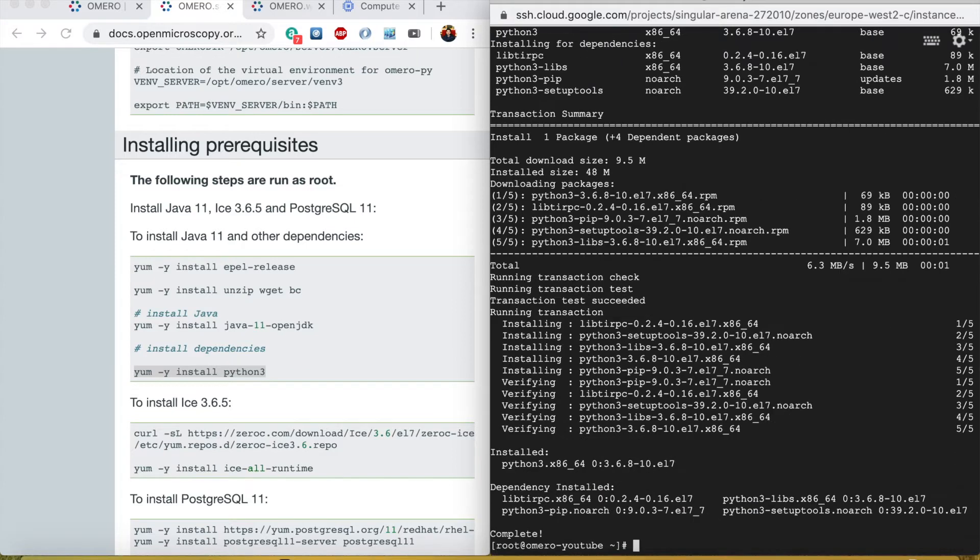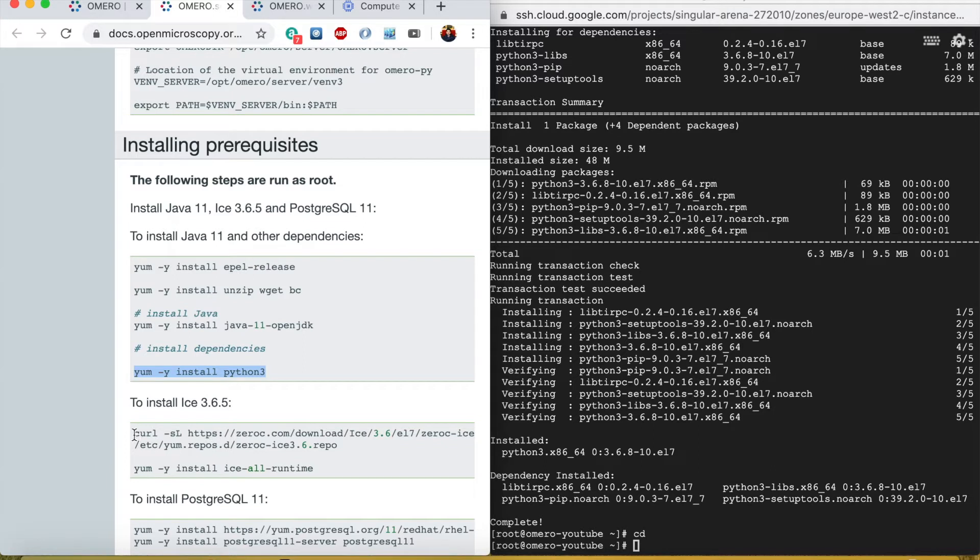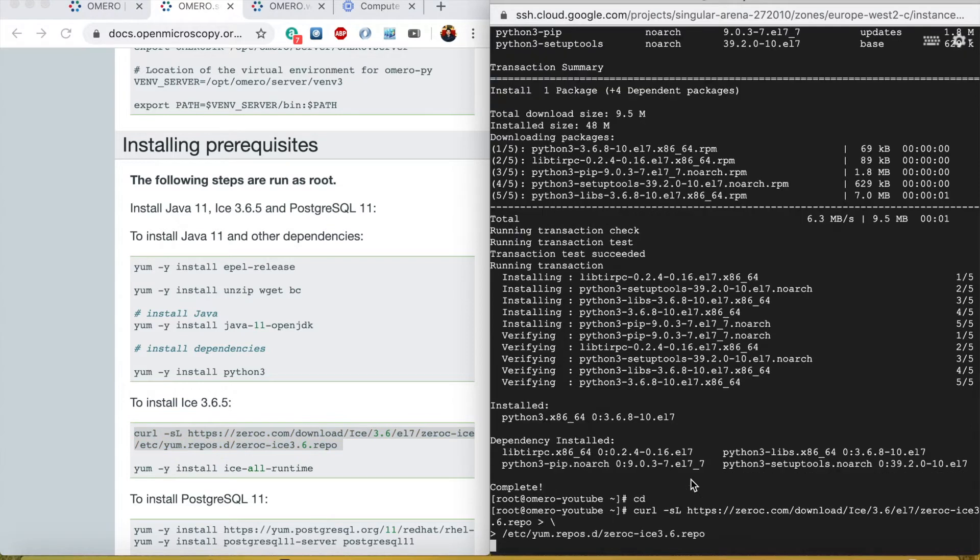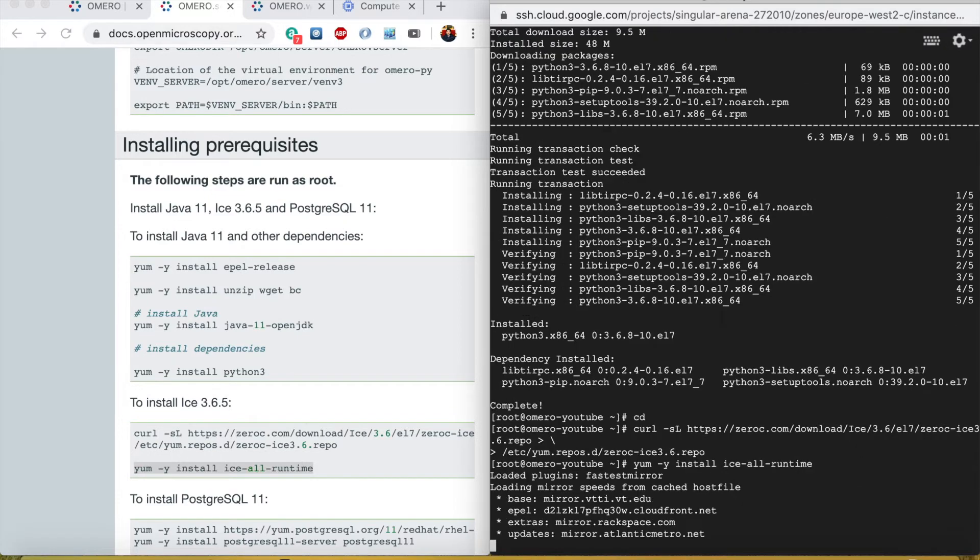Python 3 is installed. Now I will press cd just to make sure that I am in the home directory and then I will run this command to install Ice 3.6.5. We downloaded it and now I am installing it.